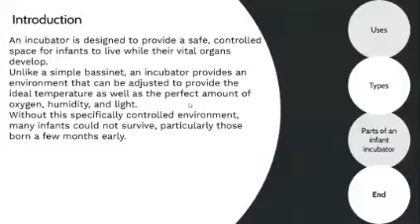An incubator is a device designed to provide a safe and controlled environment for infants to live while their vital organs are not stable and develop over time. Unlike a simple bassinet, an incubator provides an environment that can be adjusted to provide the ideal temperature and situation. Along with ideal temperature, it also provides ideal conditions for oxygen levels, humidity, and light. Without this specifically controlled environment, many premature infants could not survive, particularly those born a long time early, for example, 3 months.